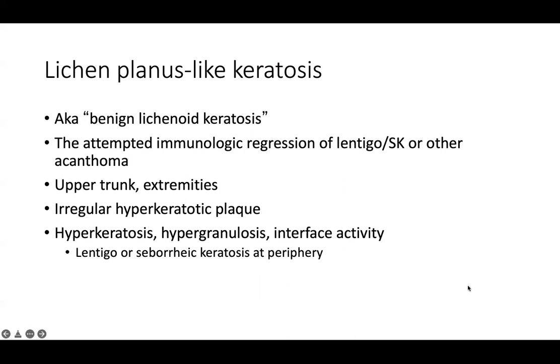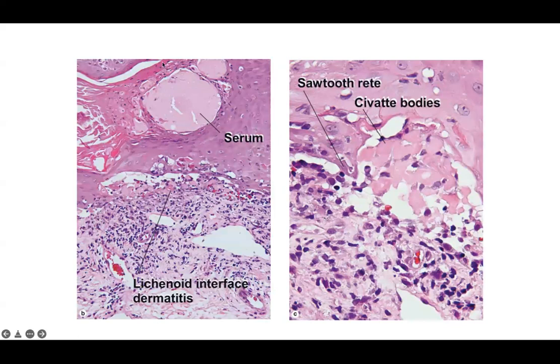That's what's being inflamed. So this is on high power. It may be hard to orient yourself, but from low power, you'll see a broad lichenoid inflammatory infiltrate. Here in the epidermis, you're seeing serum containing elements. There's a lot of inflammation. There's leakage of serum and blood components out into the superficial epidermal space.